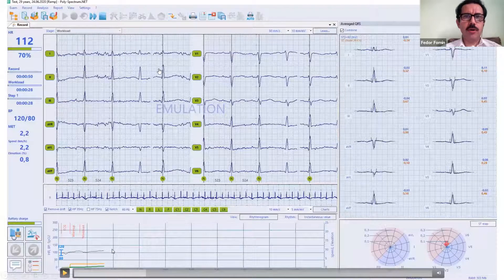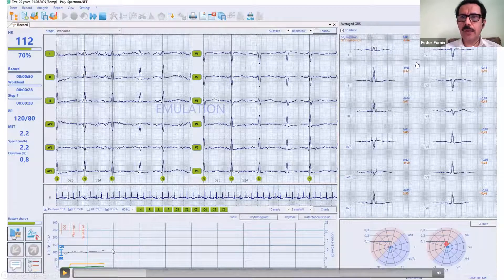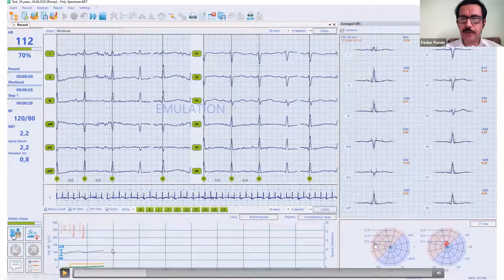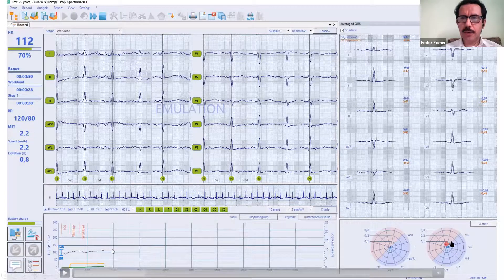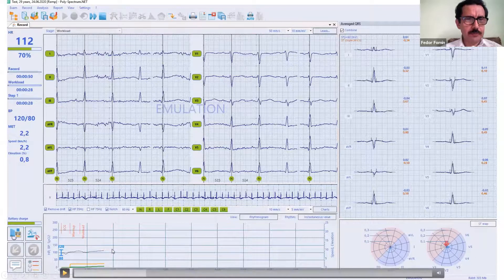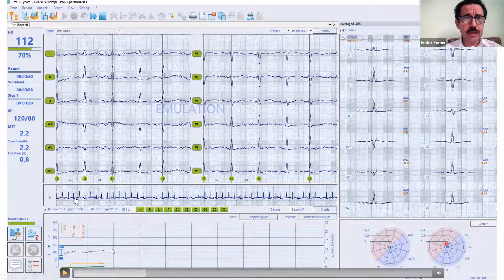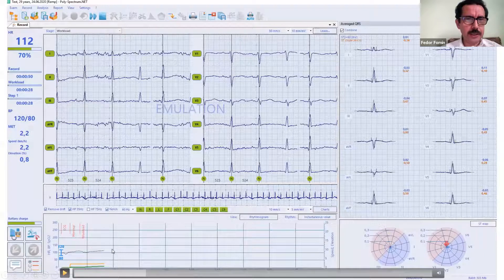We can see the main window with all 12 leads. On the right, we can see the average curve complexes for every lead, with online calculation of ST displacement and slope. We also have a nice graphical presentation of ST depression or elevation, which is important for the doctor to see not only which lead has the maximum deviation, but also how it corresponds to other leads. Below the main ECG, I have a rhythm strip, and below that I see the workload and actual heart rate.